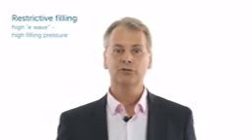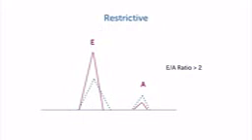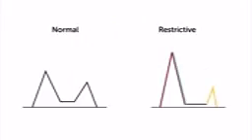If we have a patient who has a so-called restrictive filling, where we have elevated filling pressures, then this E wave will get very, very tall compared to the A wave. The value would be double as high as the A wave. And this would indicate elevated filling pressures. Again, let's compare the normal filling here to the restrictive filling. This is indicative of elevated filling pressures and, I would say, high volume status.